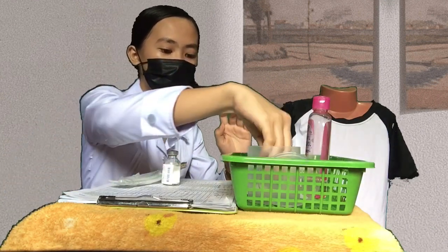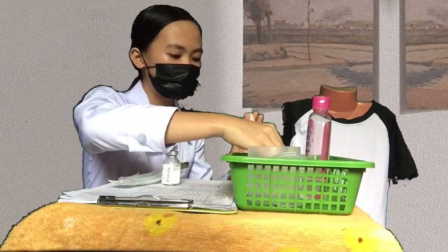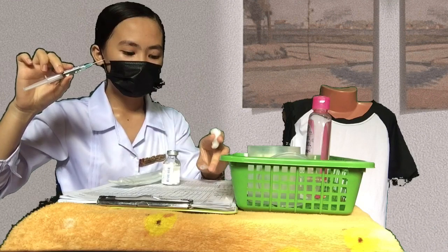But first we're going to place a cotton ball between the third and fourth finger. Okay. Then next is I'm going to get the syringe and remove the cap, making sure that the inside part is the only part that's touched by the needle to prevent contamination.